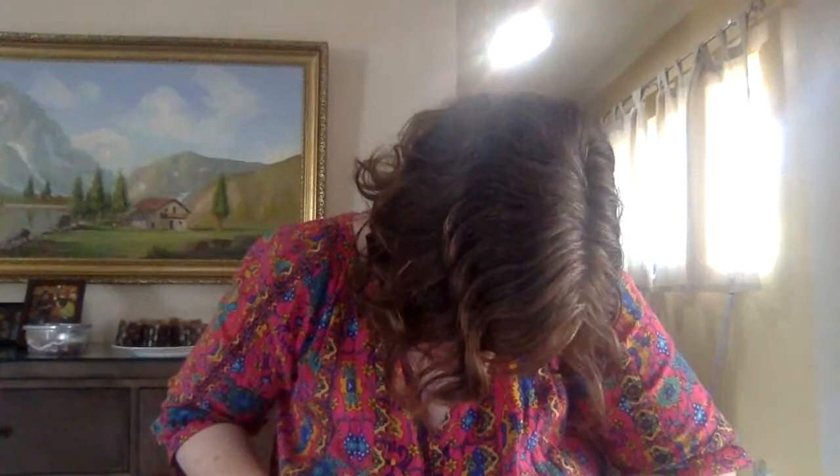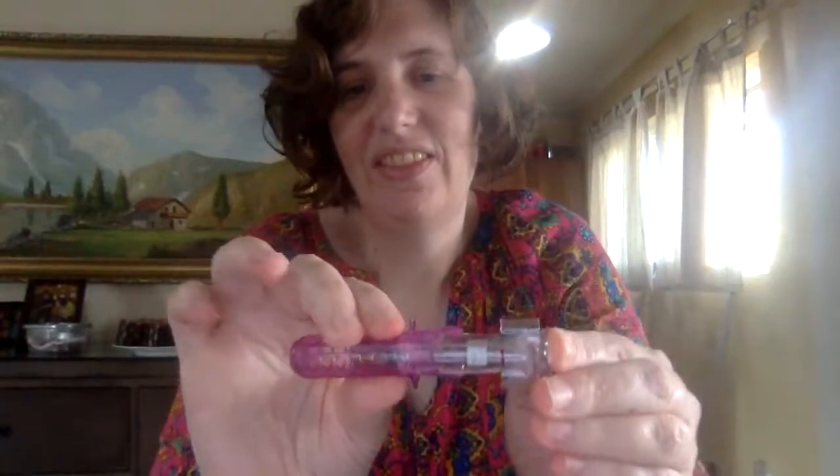This side hurts. So just gonna get the plunger. Please go until the end. I want the wings to spread apart. Go all the way inside. Plunge away. Plunge away, please pop your wings. There it is, the needle is now hiding inside.